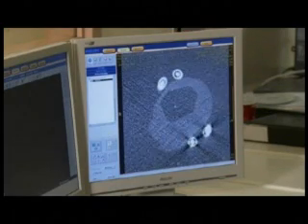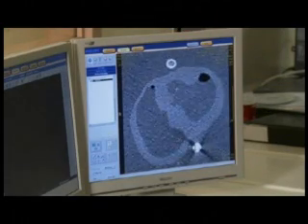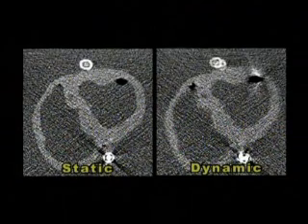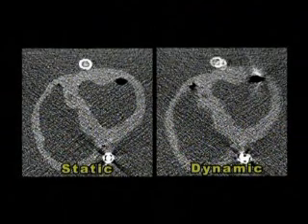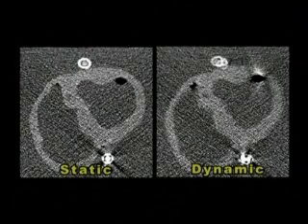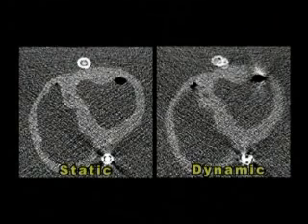By activating the phantom's computer-controlled actuators during the acquisition of CT image data, we can produce motion artifacts in the reconstruction. As you can see here, the reconstructions suffer from realistic cardiac motion artifacts, which manifest, for example, as blurry cardiac chambers and vessel shadowing.